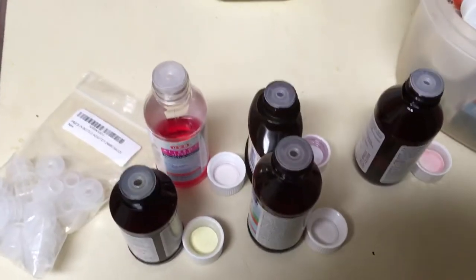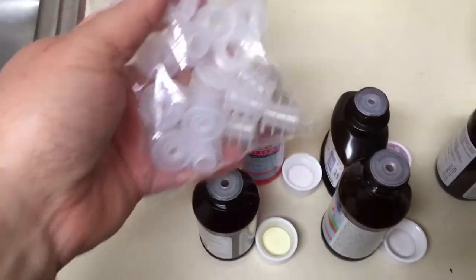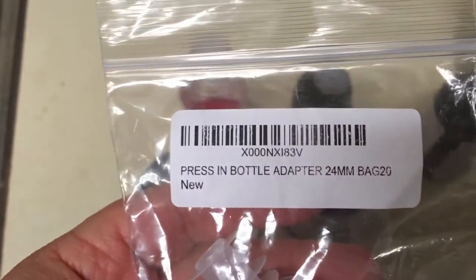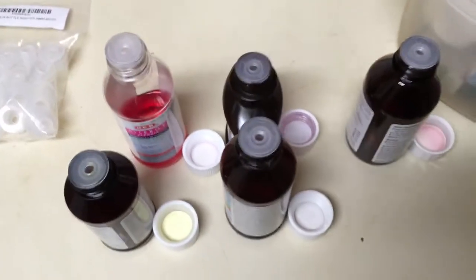All right, so we just got in our press-in bottle adapters today, and here's the bag they come in. 24 millimeter — sorry — and these are the bottles that they fit in.